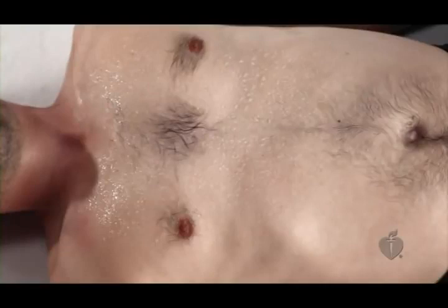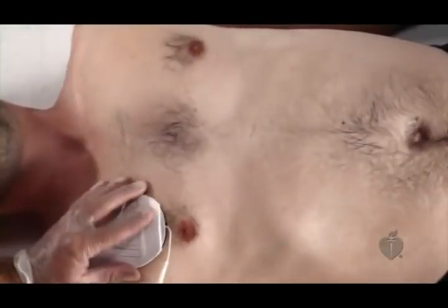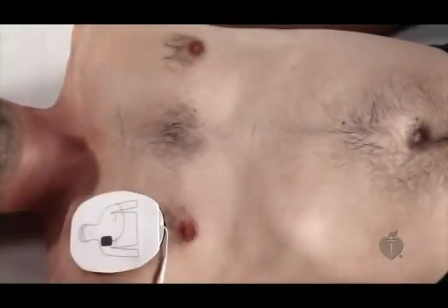If the victim is lying on snow or in a small puddle, you may use the AED. If the chest is covered with water or sweat, wipe the chest before attaching the AED pads, but wipe the chest quickly as it doesn't have to be completely dry.